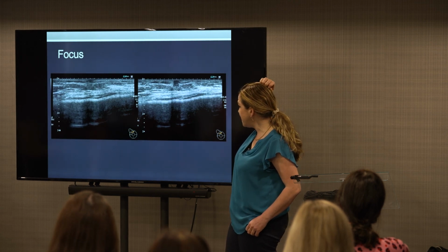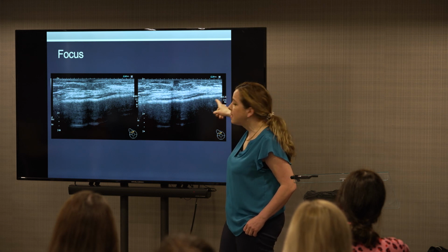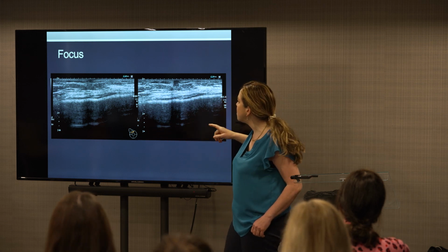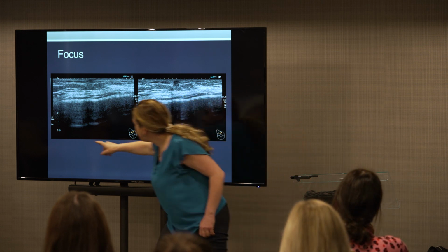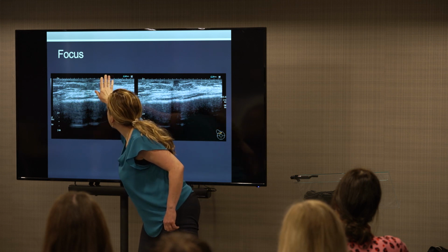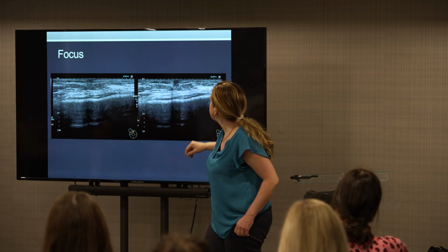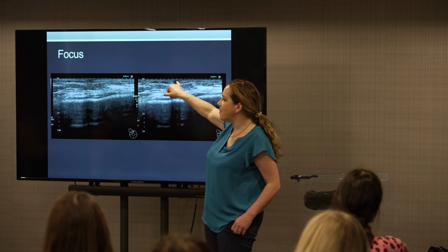So this is an example. This is actually a breast, an image I took. The lady's got an implant, but I just wanted to illustrate how important the focus is. You can see here, this is where the focus is on this image. So it's in the wrong place, and I would probably call that roughly normal. And then if you move the focus to the top on this image, there's a cancer there invading the skin.